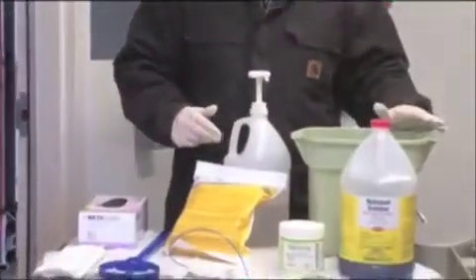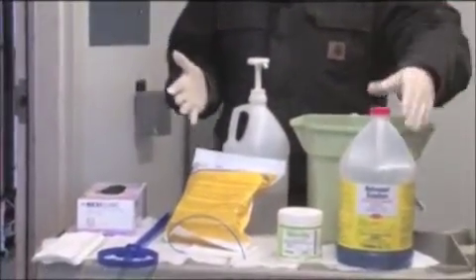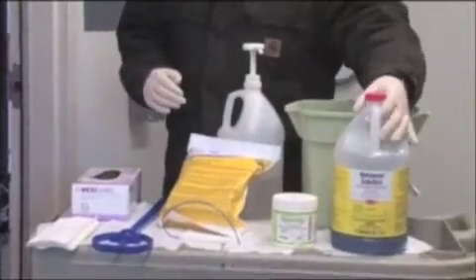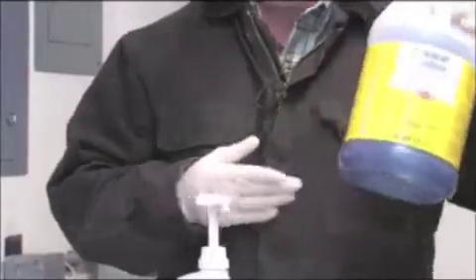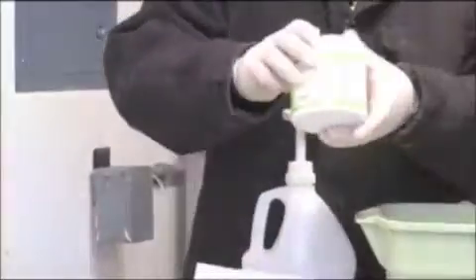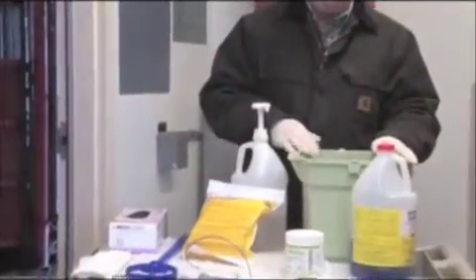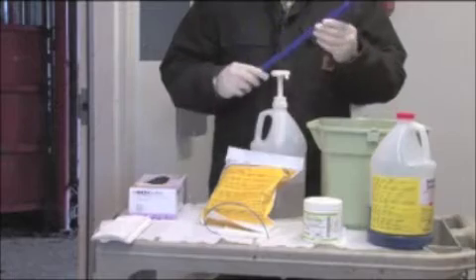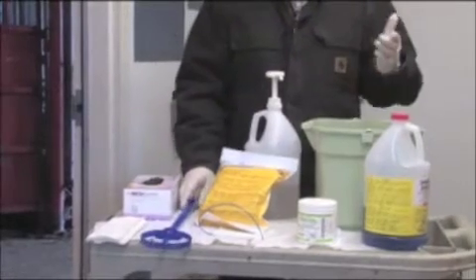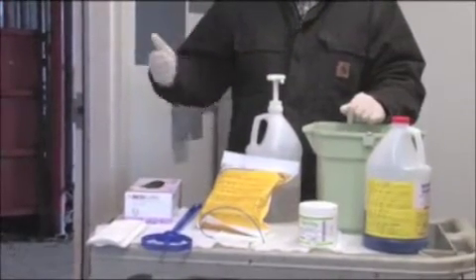Additionally, you will need a bucket of water that contains a mild disinfectant. Some of the disinfectants commonly used include Nolvasan or Betadine, both of which should be mixed at the recommended dilution level into the water. This allows you to clean the CIDR applicator or the CIDR gun between each cow to minimize the transfer of infection or disease from animal to animal.